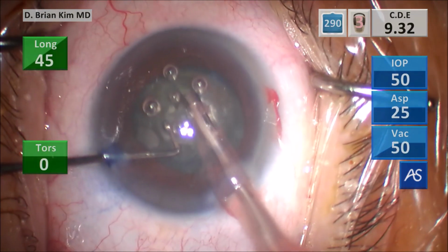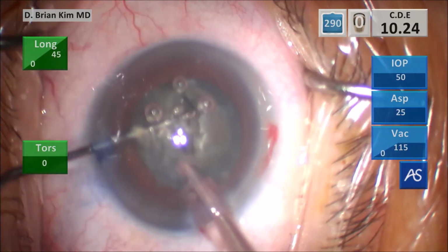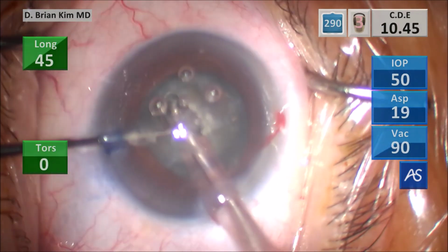And then this is the terminal chop. But before I do that, I'm going to rotate the lens 180 degrees apart. And I'm going to go ahead and sculpt a little bit more on the other side. Again, you don't have to go all the way down to the posterior capsule, which would be risky.